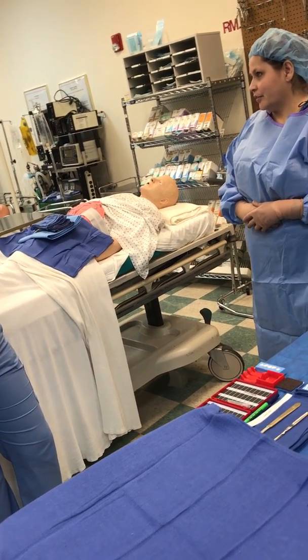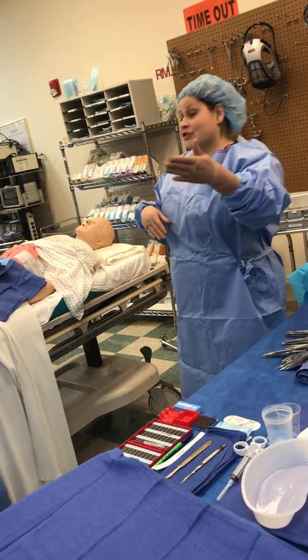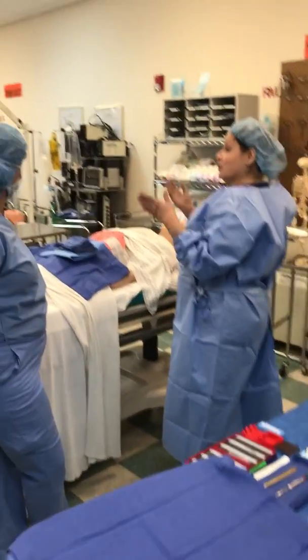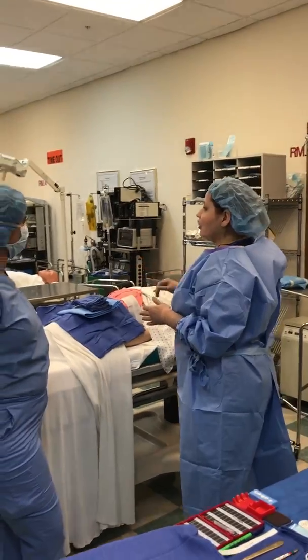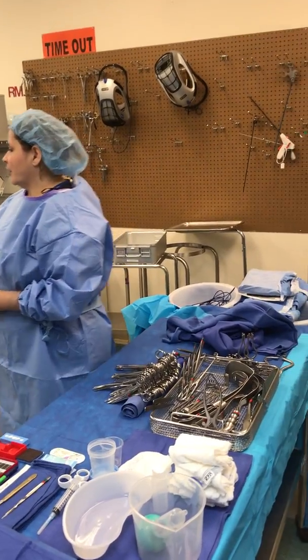I don't do any of that with my surgeons. Yours, in your house. When I'm with other surgeons that are not mine, I hand them the towel. If it's other surgeons that I have confianza with, I do that. Because if I'm in a hurry and I need to count, while they're doing that, I'm counting.